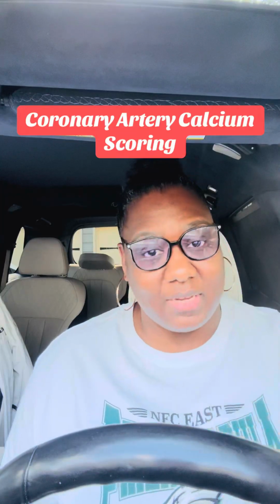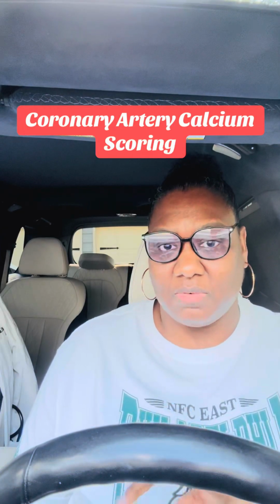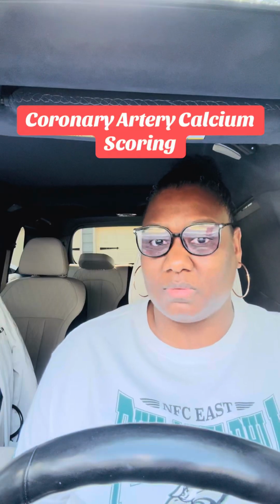Once the images are taken, then of course the interpreting radiologist has to do their part. There is a specific calculation method that is used to obtain the score of the calcium scoring test. And this is not anything that you have to calculate as a nurse or even as a layperson. You don't do that part. There's an internal algorithm that the machinery used to take the images will calculate, okay?